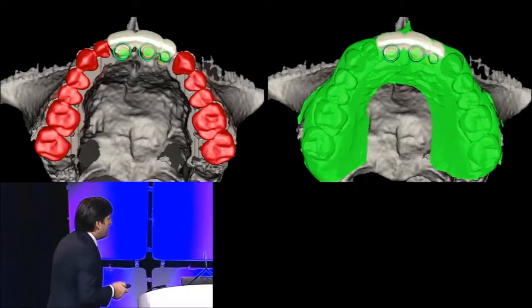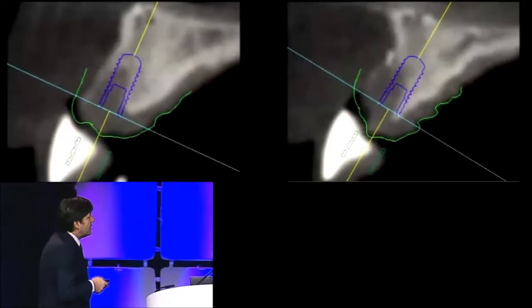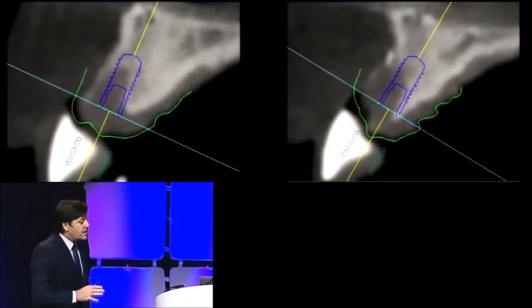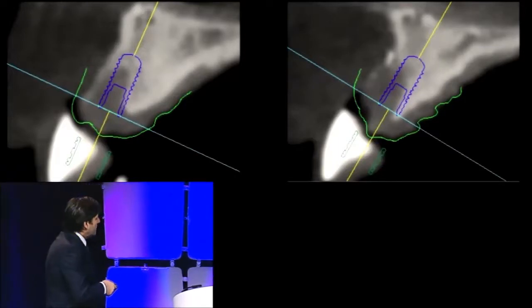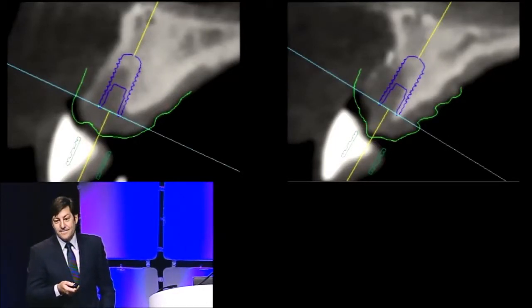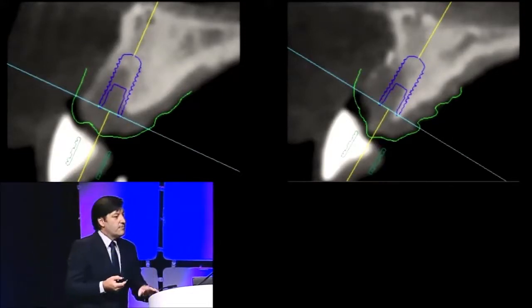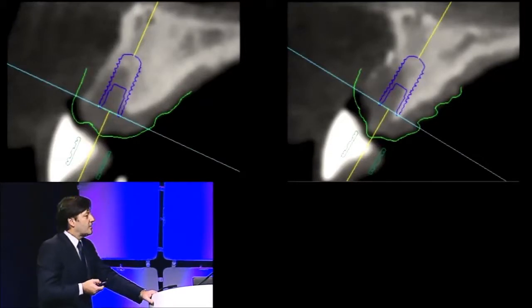Nowadays, you can have not only this information three-dimensionally, but you can have a surgical cut where you can have the prosthetic planning, the bone structure, and the soft tissue line in relation to your planning. And when I look at this compared to my 1996 bone mapping, I am really happy to report that we have made progress. This is exactly something that we all somehow need to recognize that is good for our profession.